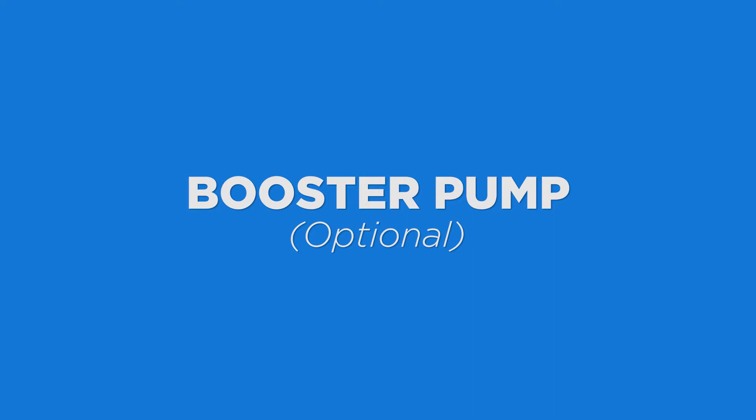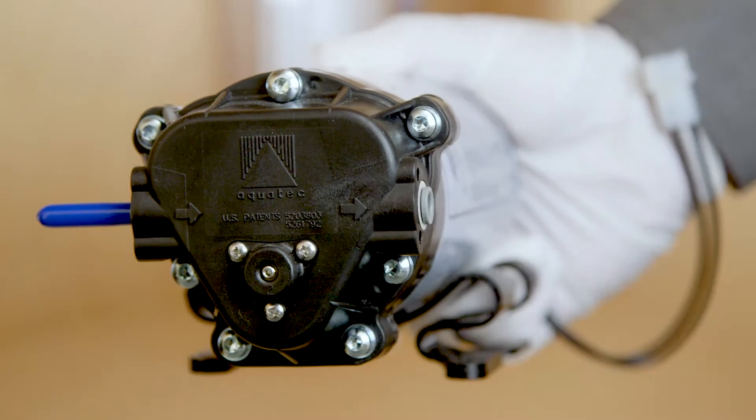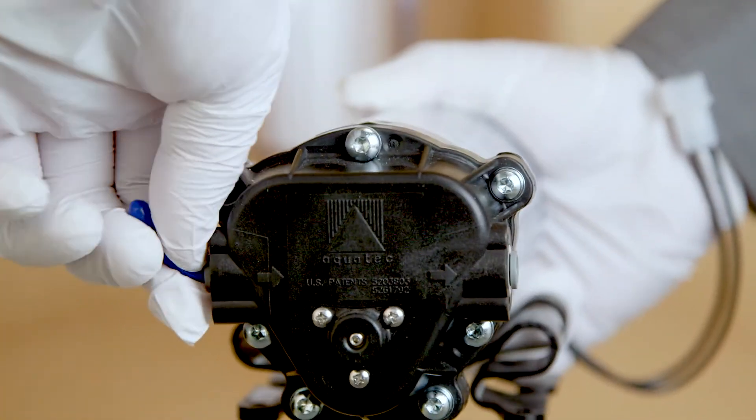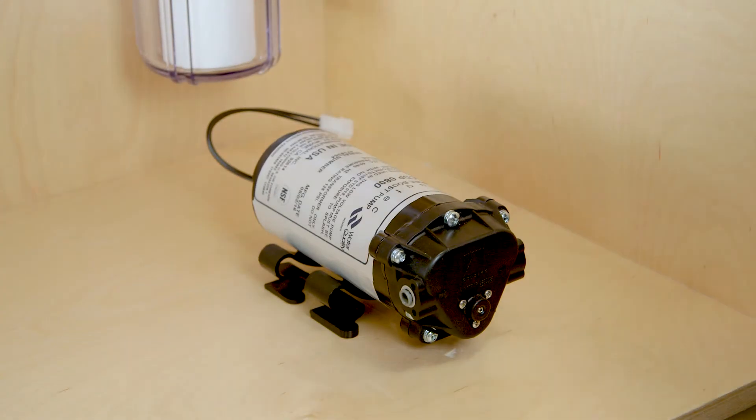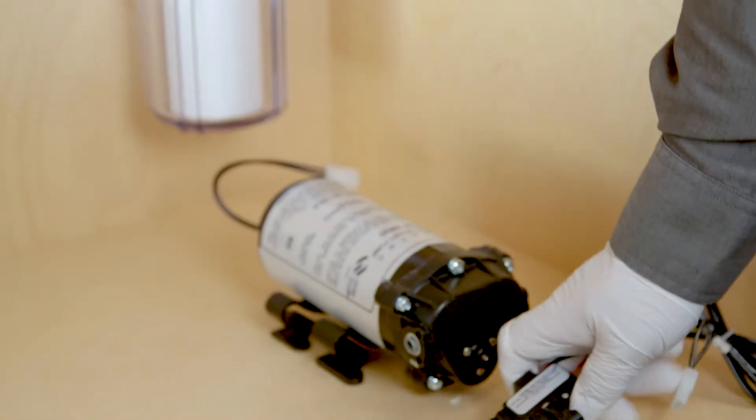Booster pump. This is optional. If a booster pump is included, start by removing the rubber plugs from the in and out ports. Place or mount the booster pump on the wall with the included hardware. Set the pressure switch aside as you'll need it later.